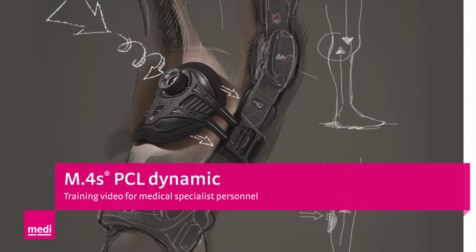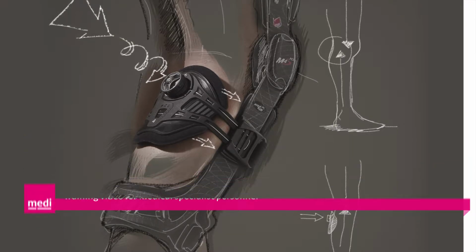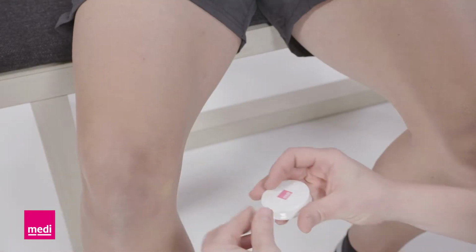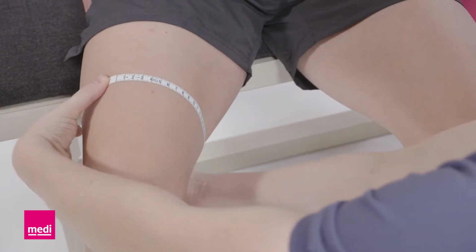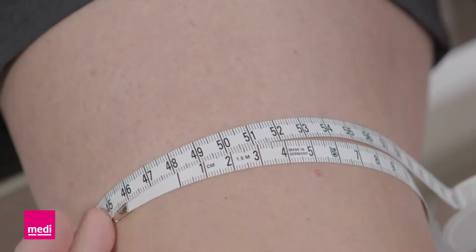In the following video, you will be shown how the M.4s PCL dynamic orthosis is correctly fitted to the knee. To determine the correct size of the orthosis, please measure the circumference of the affected leg 15 cm above the center of the knee on the medial side. You can then select the appropriate product according to the size table.